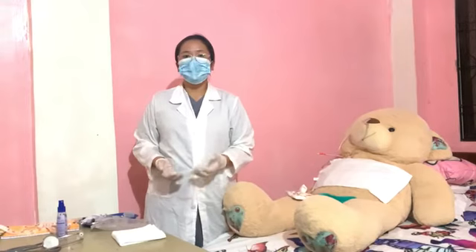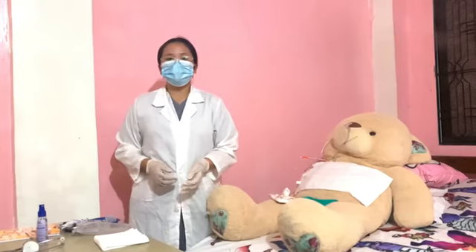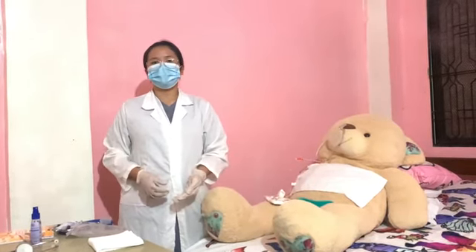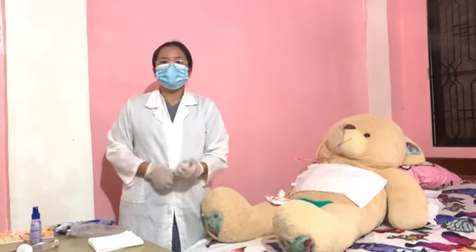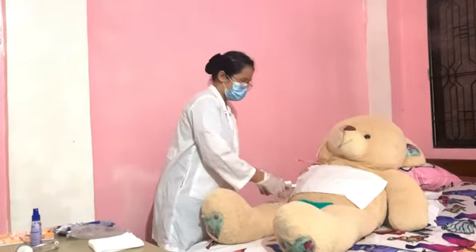And then next, assist with or provide oral hygiene at 2 to 4 hour intervals. Lubricate the lips generously and clean the nares and lubricate as needed. Offer analgesic throat lozenges or anesthetic spray for throat irritation if needed. And then, remove equipment and return the patient to a position of comfort. Remove gloves. So, ma'am, pwede ko na po ang tissue.